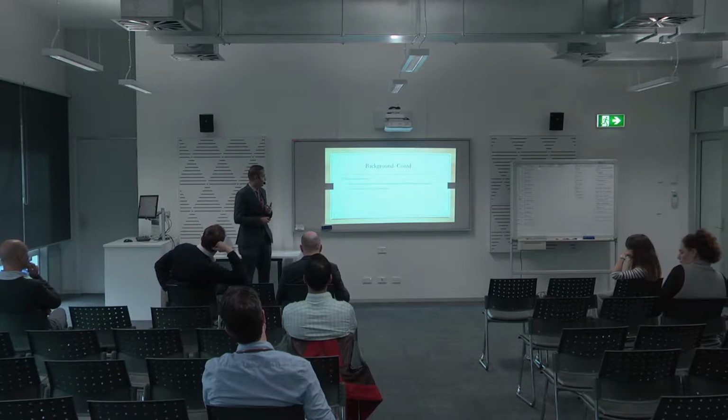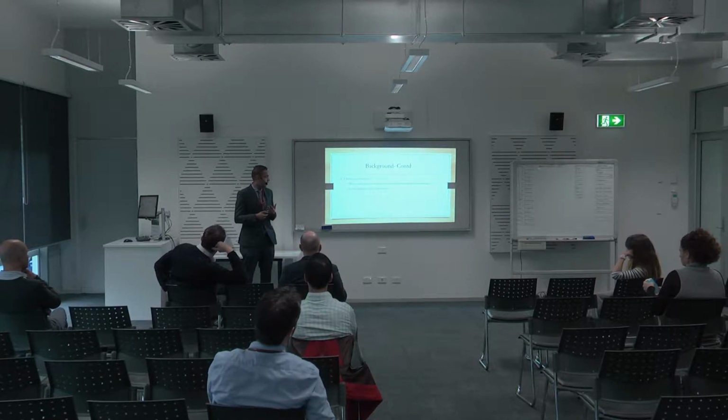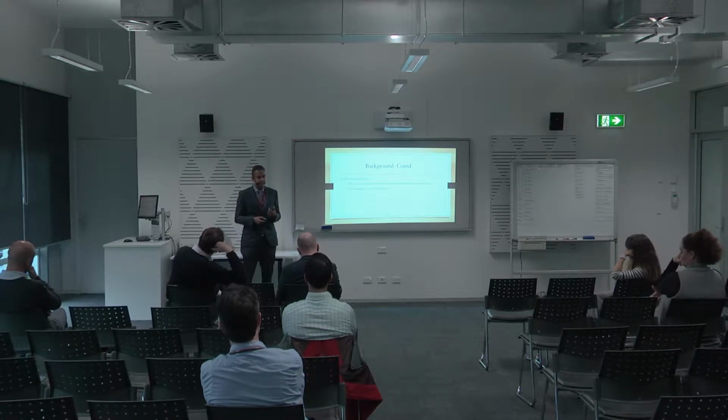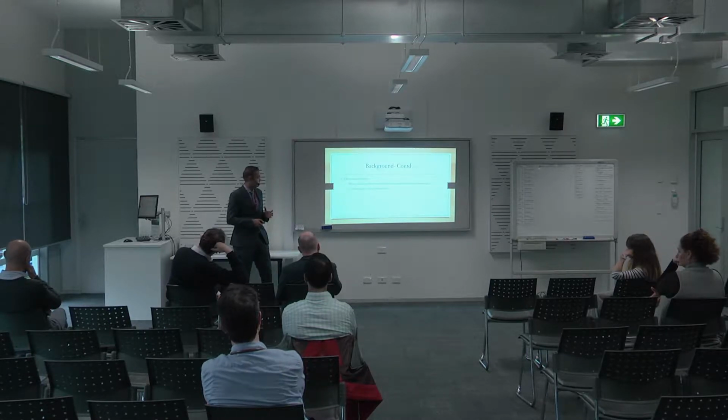Then came along chromoendoscopy. Now, chromoendoscopy is essentially where you spray the colon with dye in the form of either indigo carmine or methylene blue, and that increases the pickup of dysplastic lesions. I'll show some data around it. But essentially what happens is that it highlights the lesions, and as a result, the pickup rate increases.